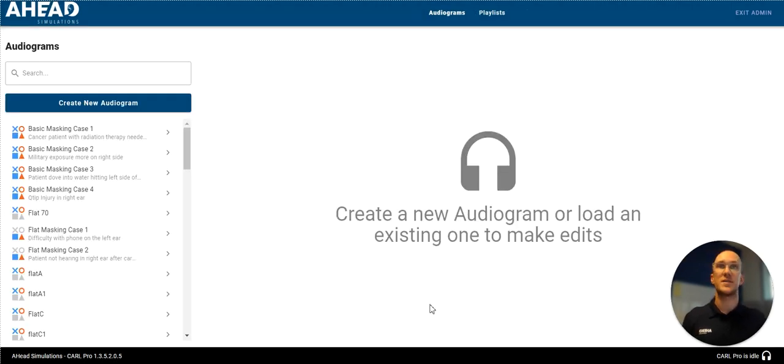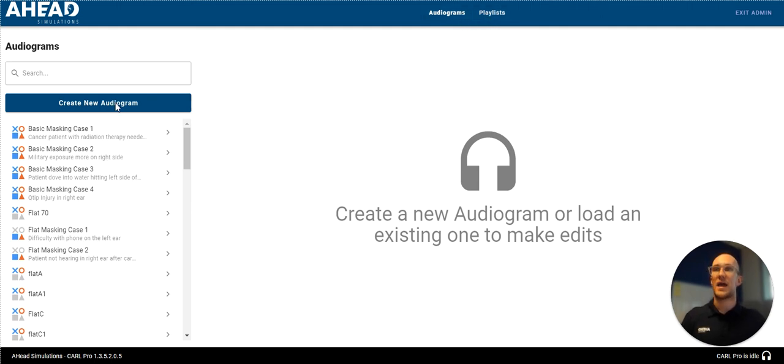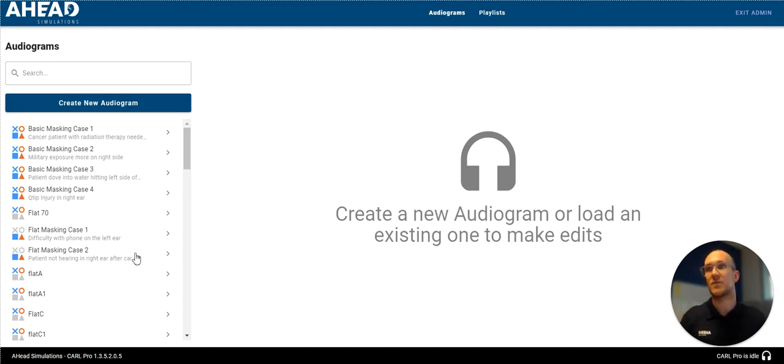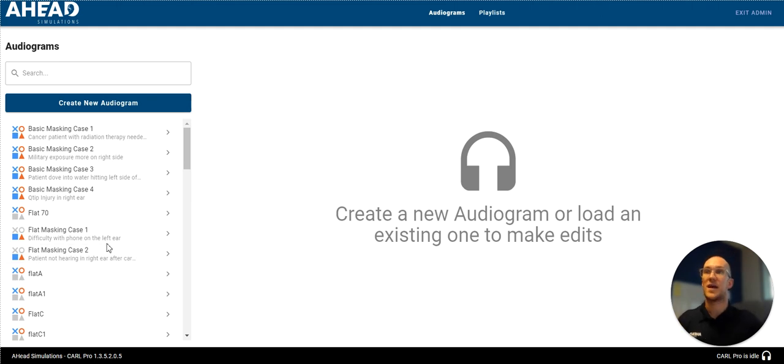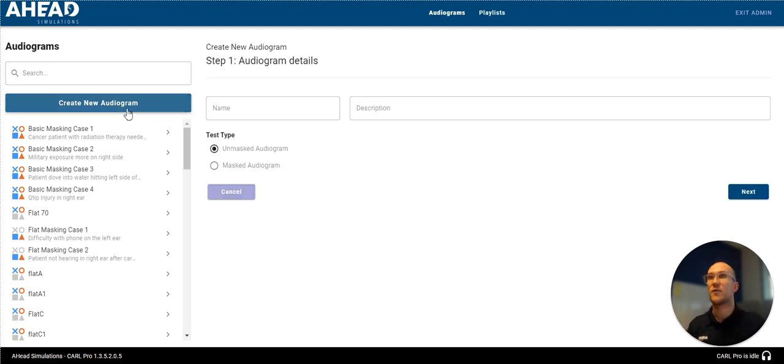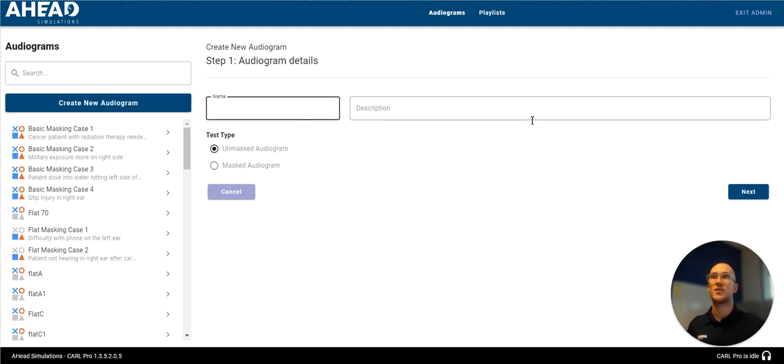When I log in, you'll see there's a little bit different of a view. You just have audiograms and playlists here. And instead of the random button that we saw before, we see a create new audiogram. We can still see all of our audiograms here that are loaded into Carl. And when we click on them, we can either edit or delete them. But today, we're going to be creating our own audiogram.